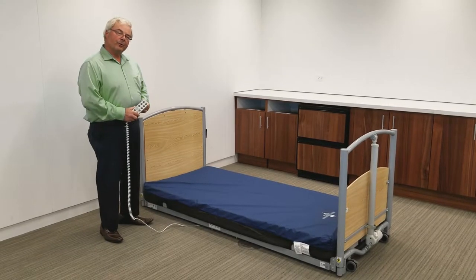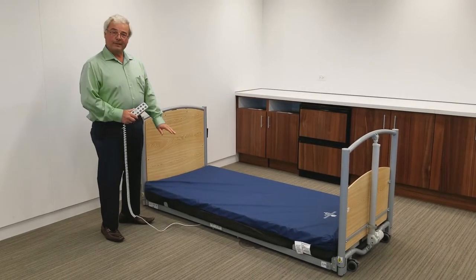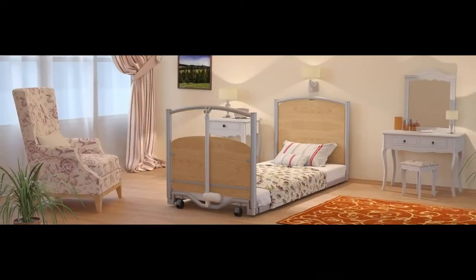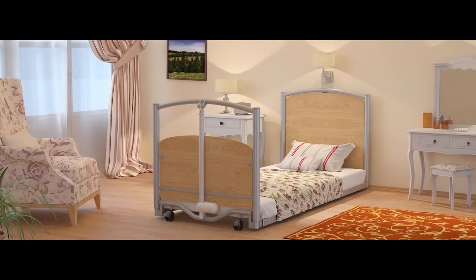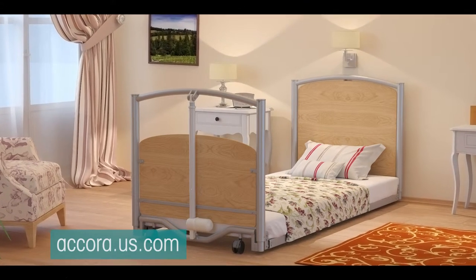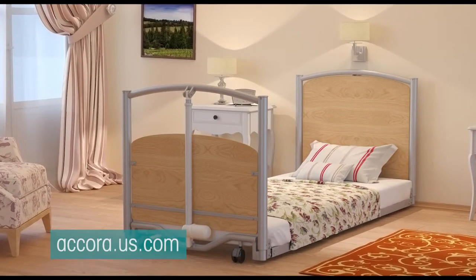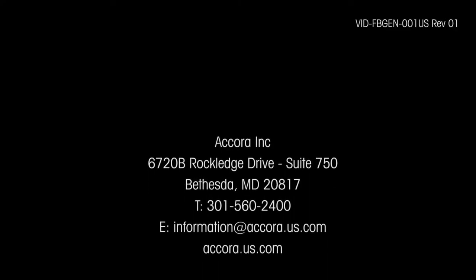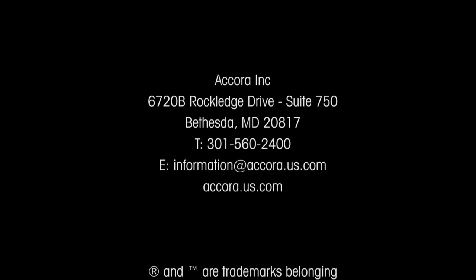In conclusion, the floor bed is a bed for all — floor level for fall risk patients, and it can be used like any standard nursing bed. The floor bed is fully compliant with the latest standards and has a high level of clinical functionality. For further information, please contact your dealer or visit our website at acora.us.com. Thank you.